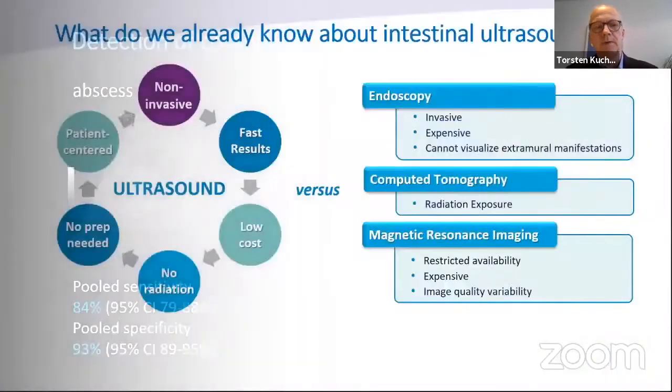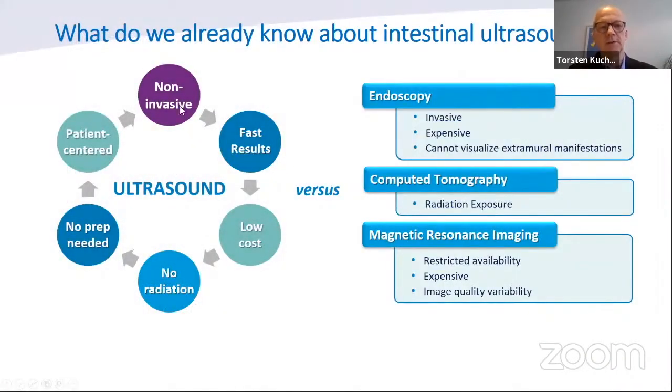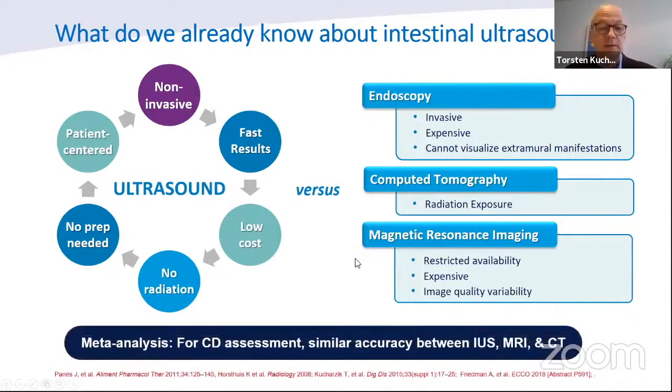So there are a lot of advantages. As you heard, it's non-invasive. You can receive fast results. It has low costs. There's no radiation. There's no prep needed. It's patient-centered. So a lot of advantages over other imaging modalities that we use: over endoscopy, which is invasive, expensive, and cannot visualize extramural inflammation, or computed tomography, which has radiation exposure, and MRI, which has restricted availability.